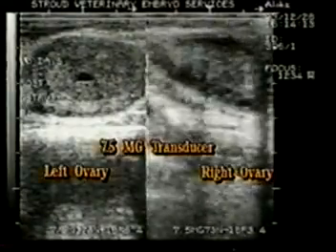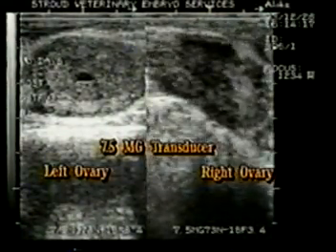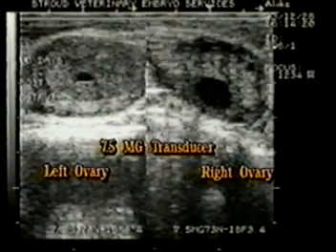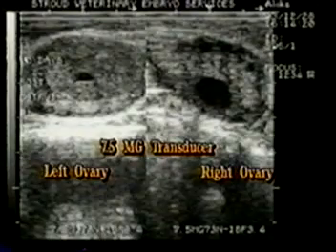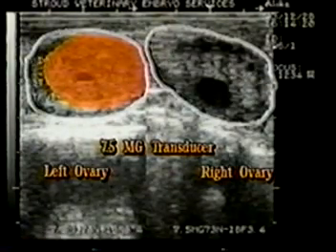These ovaries on the split screen appear very large. Up until now, a 5 MHz transducer has been used for this video. However, this image is produced with a 7.5 MHz transducer, which appears to enlarge the image. The 7.5 transducer will give a slightly more resolved image, but at the expense of losing penetrating depth.